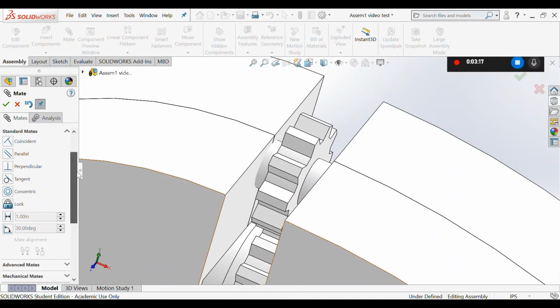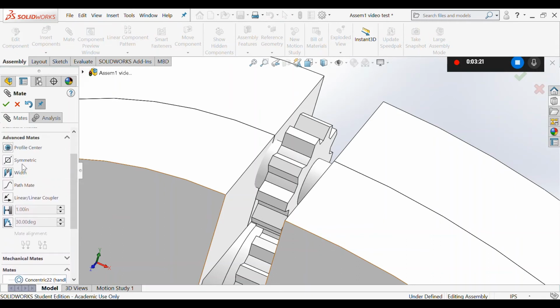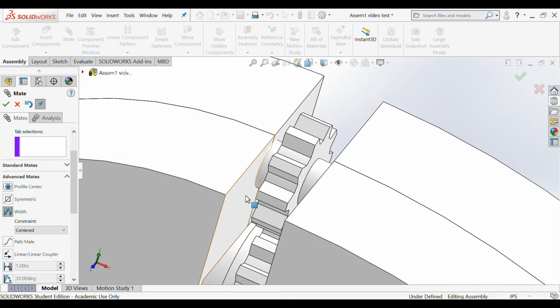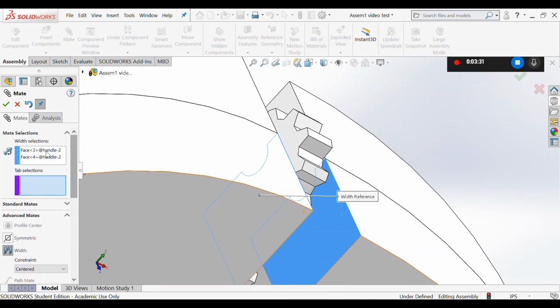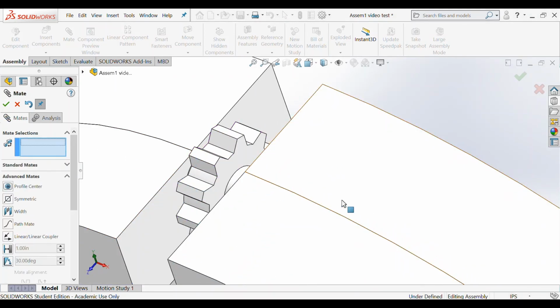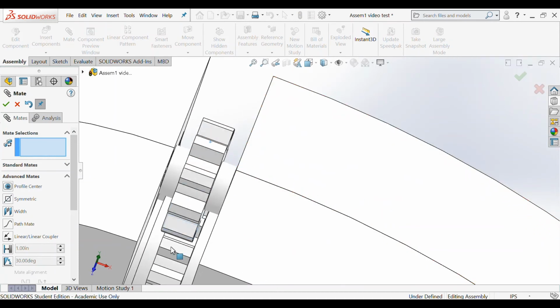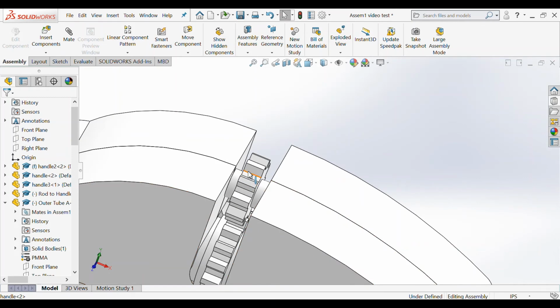Now I'm going to add one more mate, but this time it's going to be another width mate. So I'm going to choose advanced mate, width mate, and choose the outer surface here and the outer surface here for the width selections, and then for the tab selections I'm going to choose the outer surfaces of the gear. I'm going to click that green check mark. So doing a width mate allows me to maintain this gear's position halfway in between this side of the handle and this side of the handle while still allowing it to rotate. So I'm going to click that check mark.